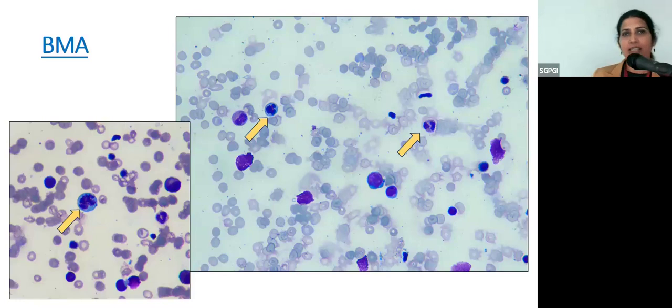Okay, this is dysmyelopoiesis. And another one, if you identify the cytoplasm, this is the erythroid cell. This is showing you dyserythropoiesis. Another arrow there, again, dyserythropoiesis. So that is all we saw. We could not tell what the cellularity was because the marrow was completely diluted, aparticulate. What we saw was some myeloid and erythroid precursors with dyserythropoiesis and dysmyelopoiesis.